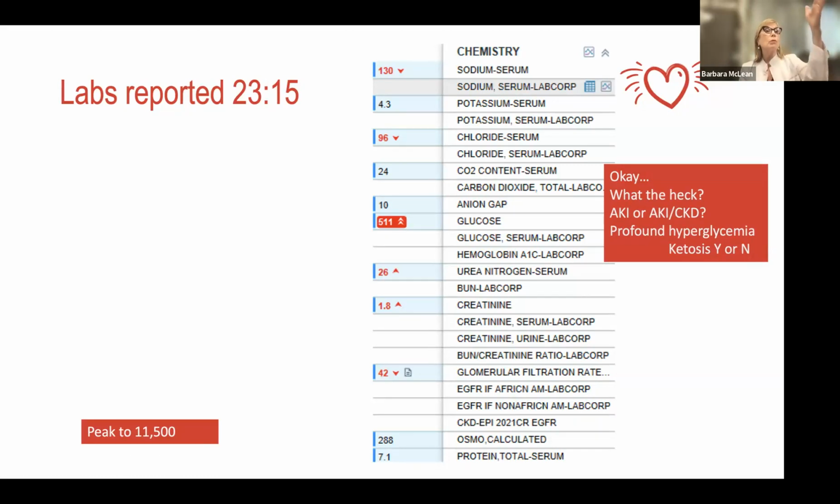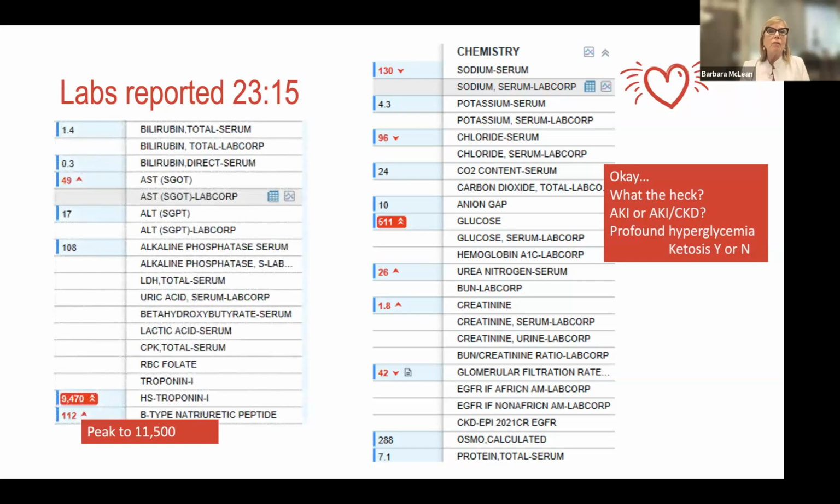They take a long time to accumulate and a long time to clear. So they're not real-time, right-now data. The real-time, right-now data is anion gap. Patient's got a normal gap. So I don't think he has ketosis. I do think he has a beginning of AKI. I'm pretty worried about the guy. Don't think he looks too good. And then I get this. Okay. So here's what I get, right?